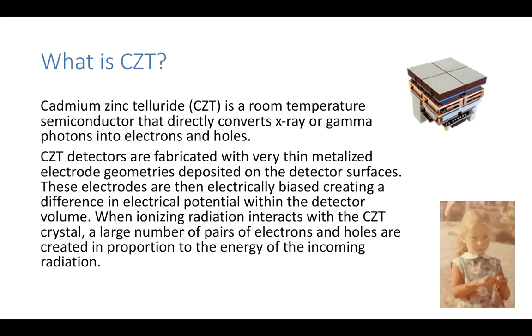When ionizing radiation interacts with the CZT crystals, a large number of pairs of electrons and holes are created in proportion to the energy of the incoming radiation. So at the end, you can obtain an incredible amplification of the signal. But what is the reason to use CZT for clinical purposes?